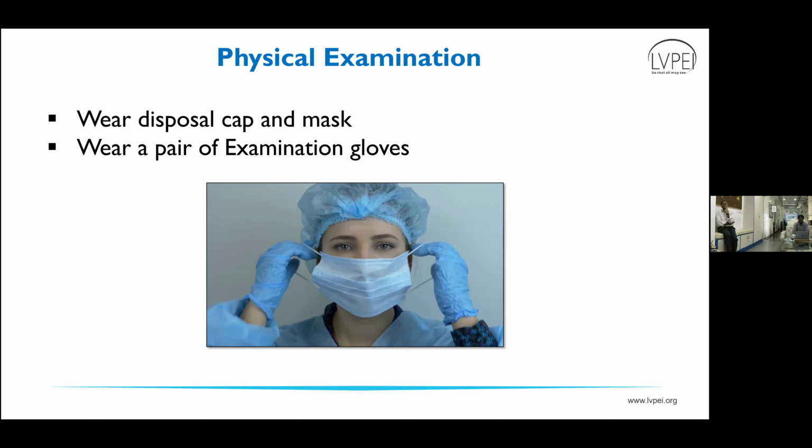Before starting the recovery, we need to do the physical examination of the deceased and the ocular examination, a torchlight examination of the eye. This will tell us something about the donor history, and also whether there is any evidence of infectious diseases on the body.